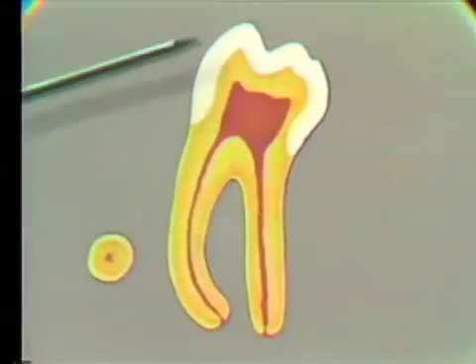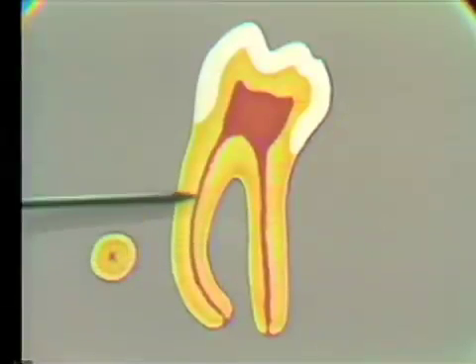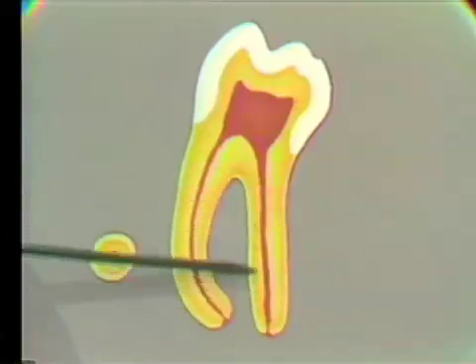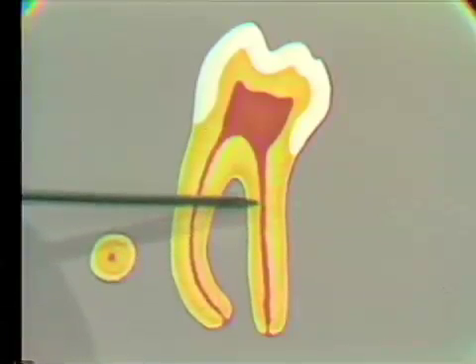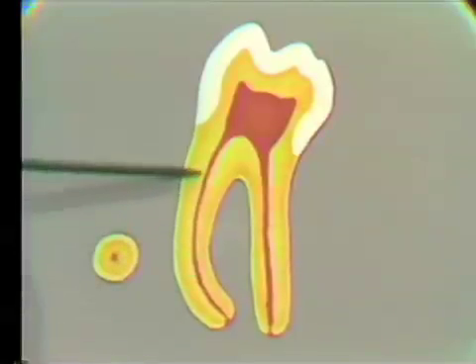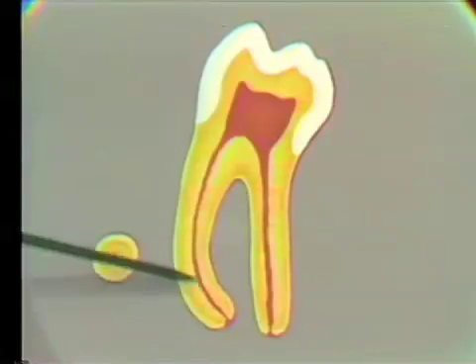These are the kinds of teeth that you'll see curved canals in: lower molars, the mesial roots, the buccal roots of upper molars, and often on maxillary laterals. The distal root canal is a lot straighter and larger, so this one should be no particular problem. The mesial is very fine and very curved, and you often run into problems with ledging the tooth right down here and then not being able to complete the final root canal.